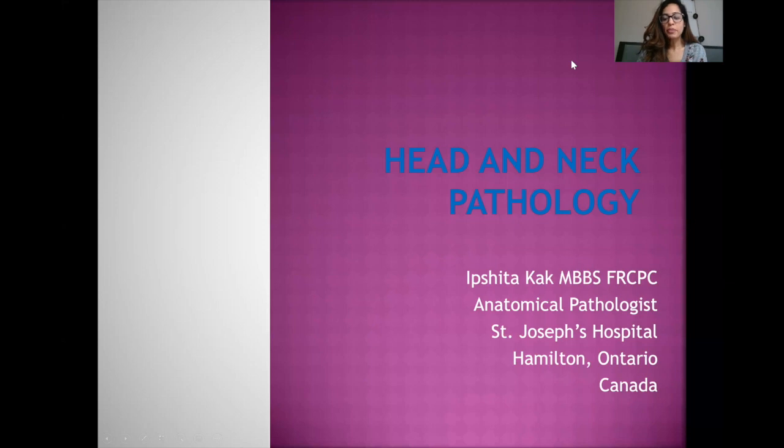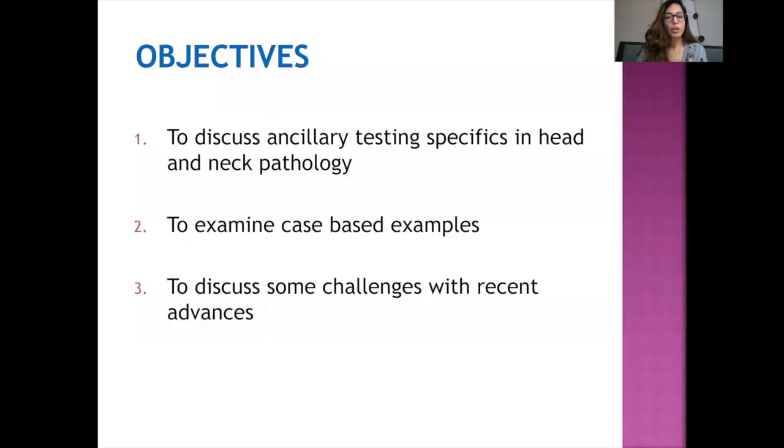Thank you, Dr. Gupta. So I'm going to be talking today about head and neck pathology. More specifically, I'm going to be touching on ancillary testing specifics in head and neck. We're going to look through some case-based examples and discuss some challenges with recent advances.